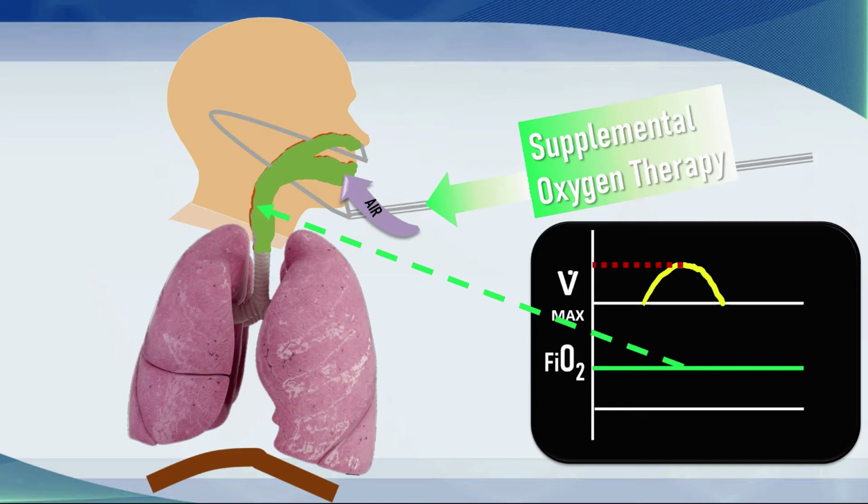However, if the oxygen flow rate or reservoir is lower than what is demanded during peak flow, the FiO2 is lower than expected. And that is why the performance of these devices is variable and why they may be inappropriate for treating patients with respiratory distress.